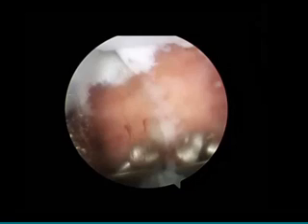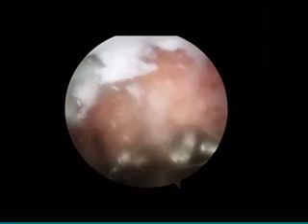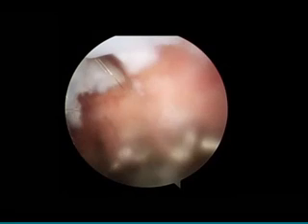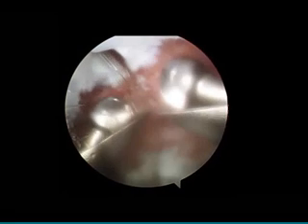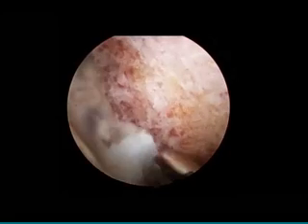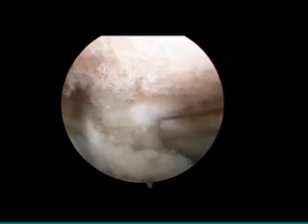And then there are newer burrs out now that allow me to go in, some of the eggshell-shaped burrs. If I can give you one clue to doing this, it's to use the Arthrocare wand to take away the capsule. Here I am on the medial side. You can see the cancellous bone on the medial malleolar region. This does take a little bit of time. I don't think I can do it in less than an hour both sides.